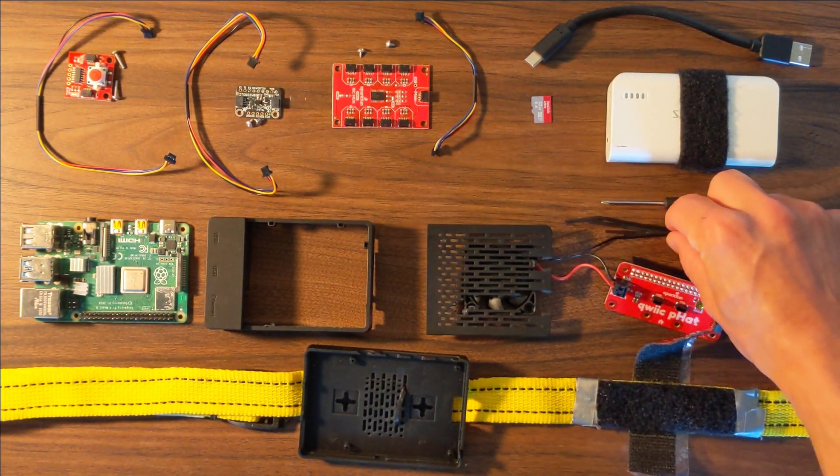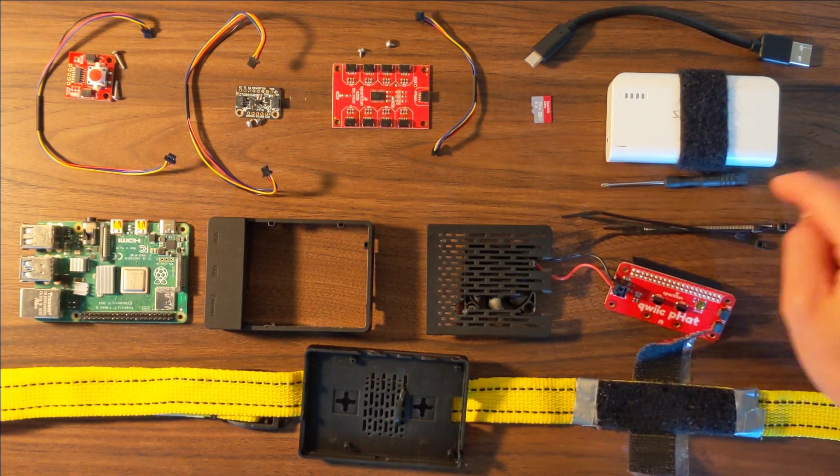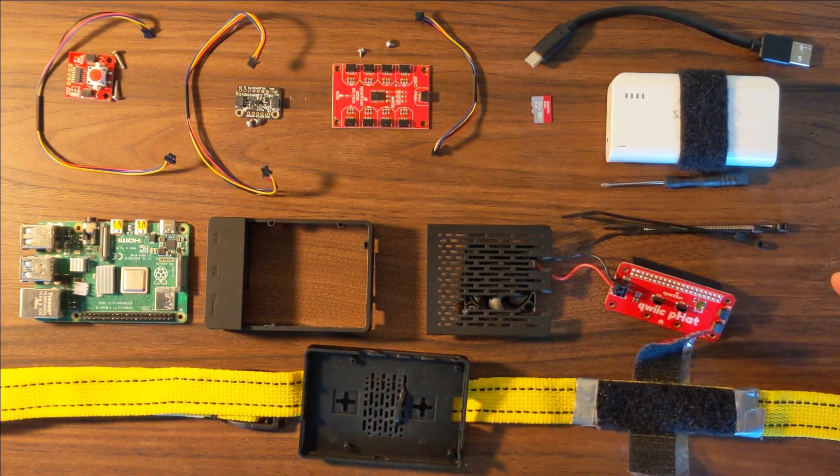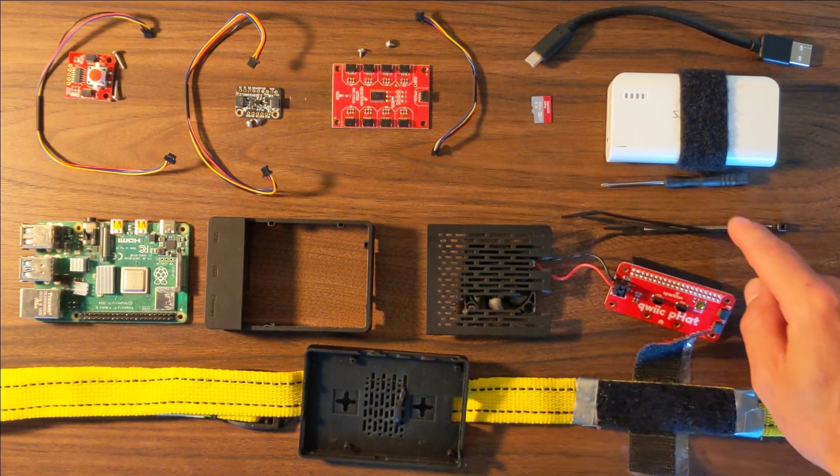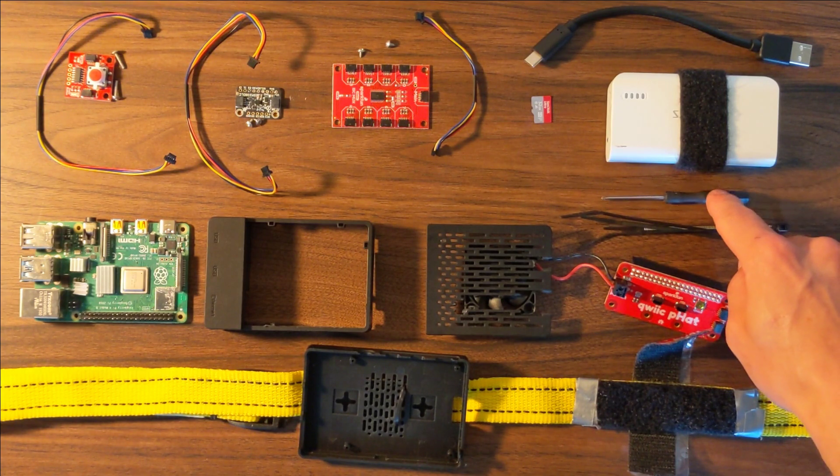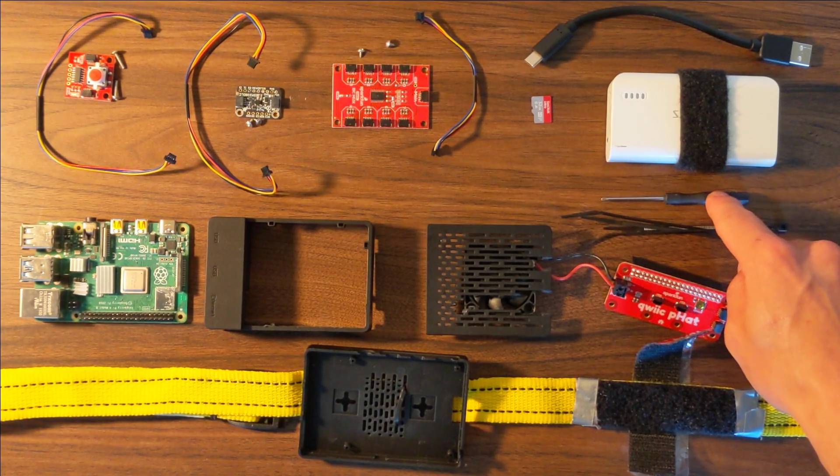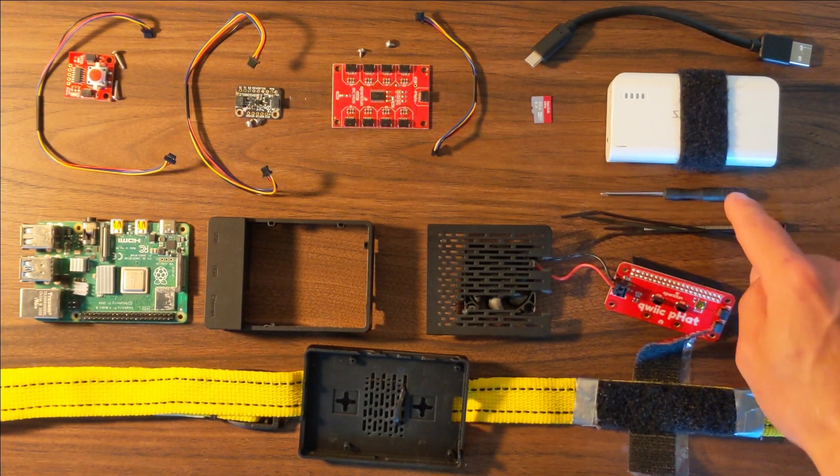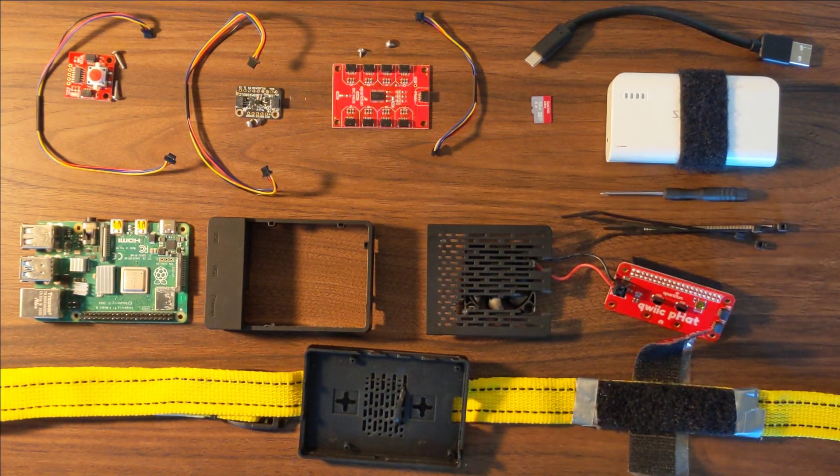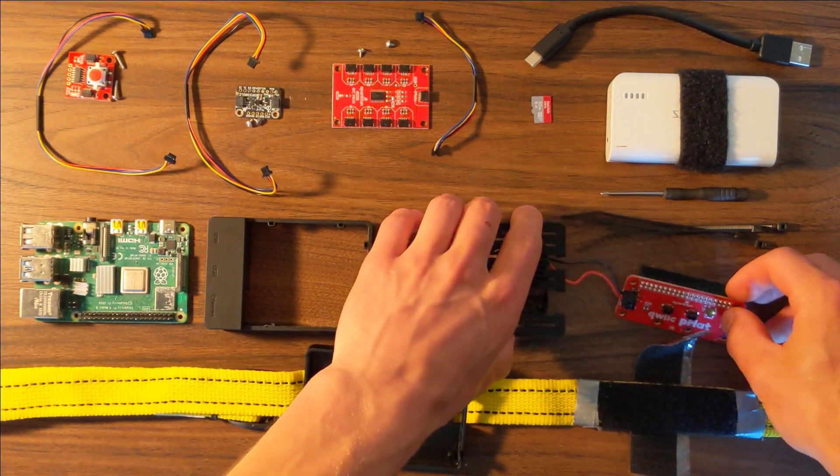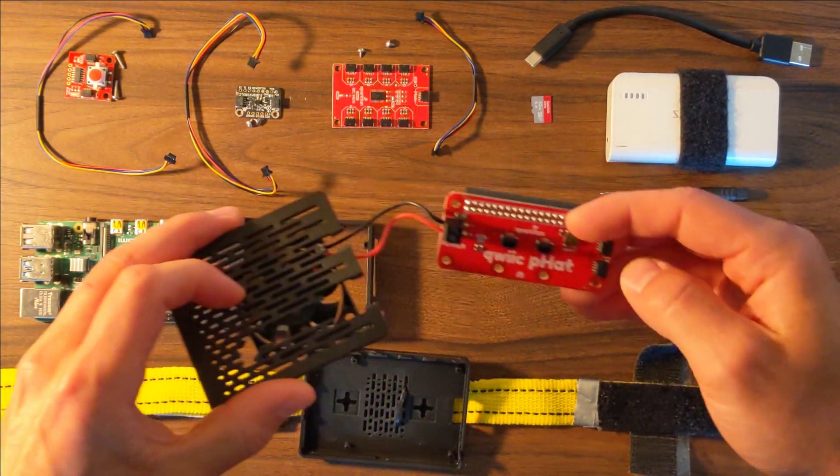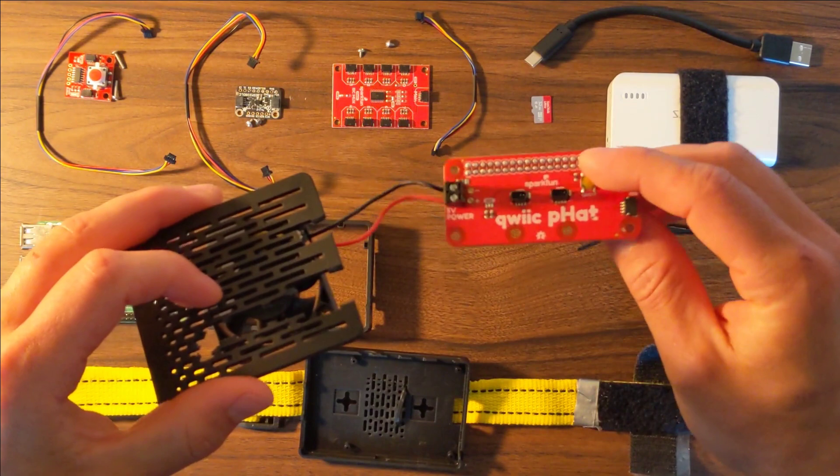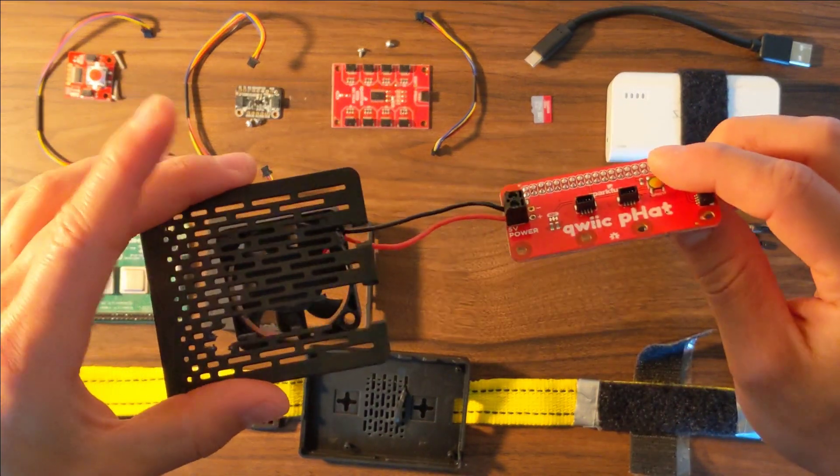I've also got some zip ties for securing the device later and this little screwdriver comes with the fan which you'll need. If you open up the case, I've done a couple steps here.